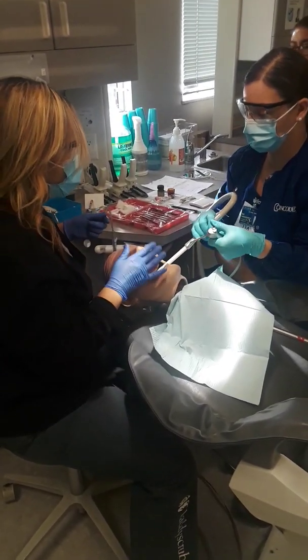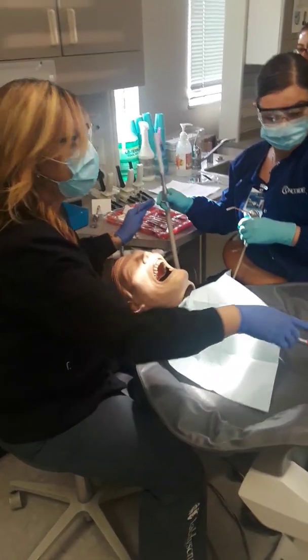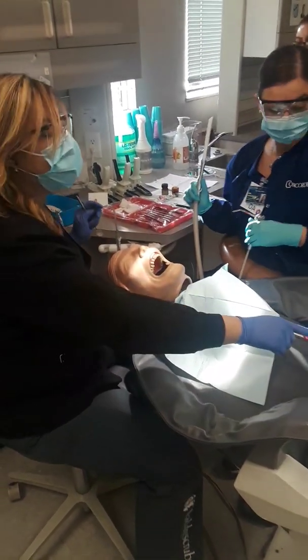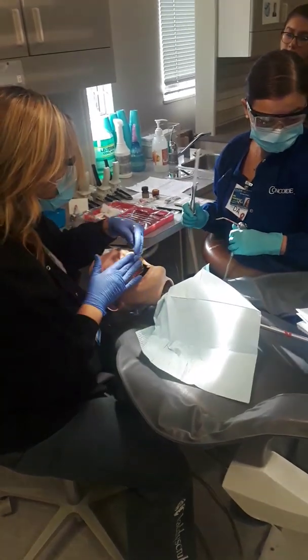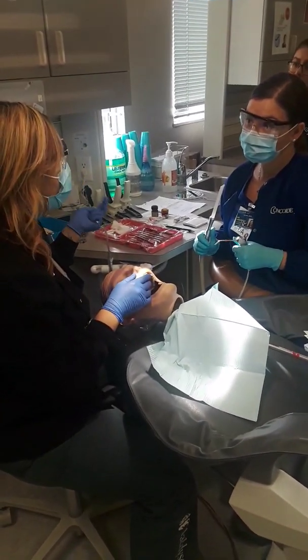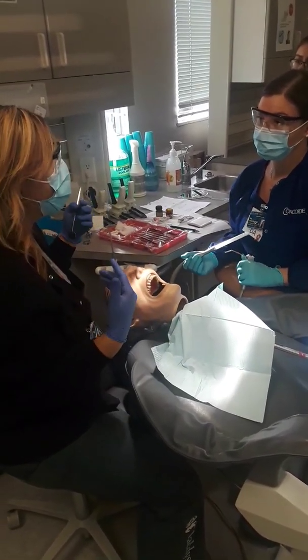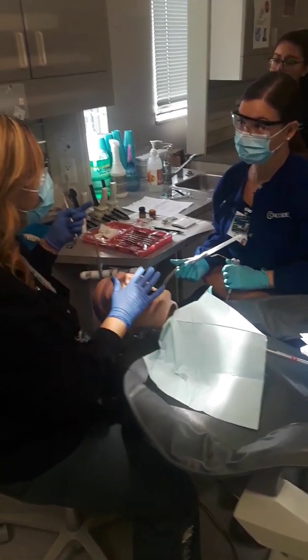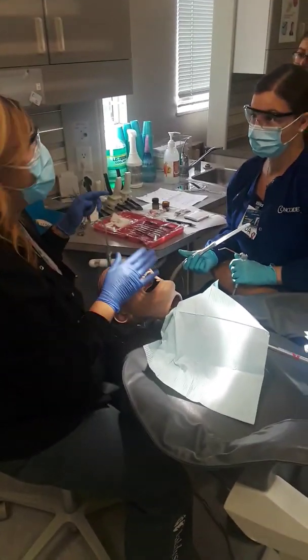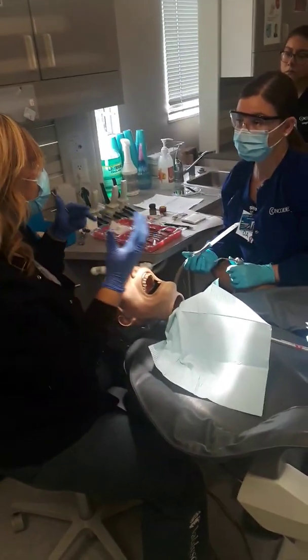Then, okay, so then, in your office, your steps don't tell you this is about to happen. So if we use a Fisher burr or a round burr, we have to build the tooth back up to what we removed. So we'll do another filling in here. So we'll add a filling to that. So that's called a buildup. Okay, so we'll build the tooth back up to whole because we had to reduce some.